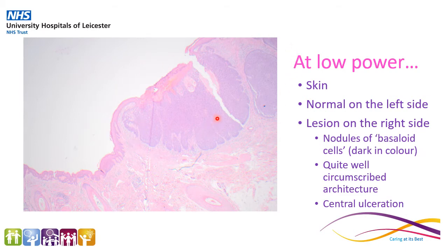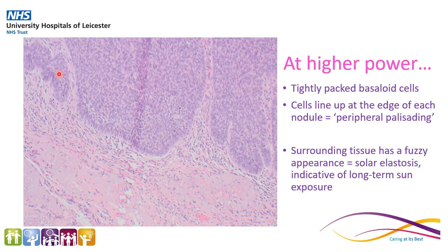This would be described as nodules of basaloid cells. These are dark in colour and it's quite well circumscribed — I can draw a line around it quite nicely. And there is an area of central ulceration, which was what he would have seen as the scab. Looking at higher power, we've got tightly packed areas of these basaloid cells, i.e. dark-coloured cells. These show an interesting feature where the cells at the edges of the nodules line up in a feature we call peripheral palisading. This picture also shows that the surrounding tissue has quite a fuzzy, bluish appearance. This is something we call solar elastosis, and this is indicative of long-term sun exposure.